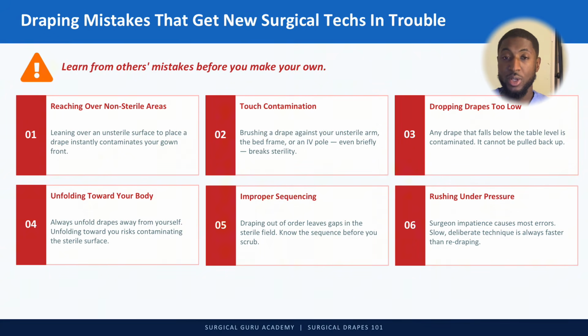So for example, we towel out the area that we are going to do surgery. So let's say we are doing a laparotomy surgery. We will towel out the area, right? Give the doctor all 4 towels. They put them down, they clamp them, or if they're sticky towels, they put them down. Then the next drape that they will take will be a down sheet, which will go over the legs. That way you can more comfortably drape. You're not risking contaminating yourself because you're slowly starting to cover the areas that you're standing in, right? So that's what it means by proper sequencing.